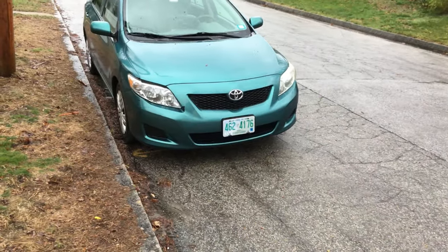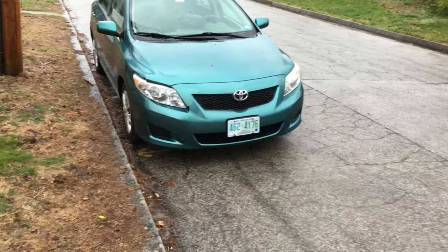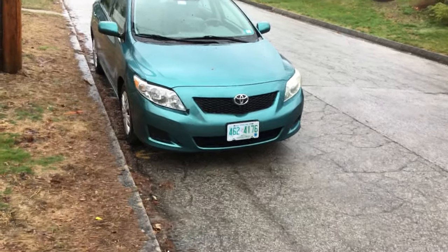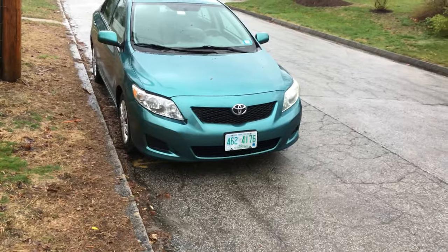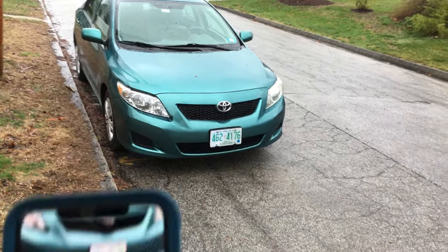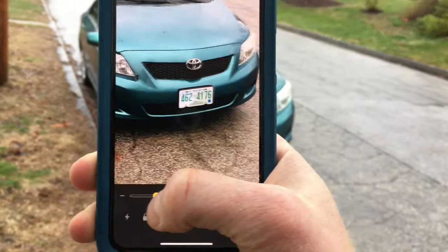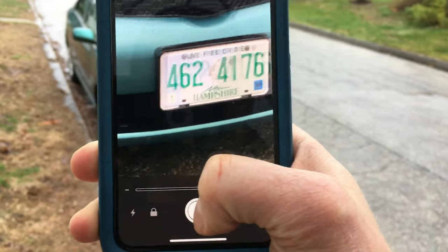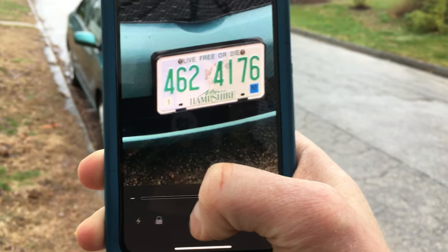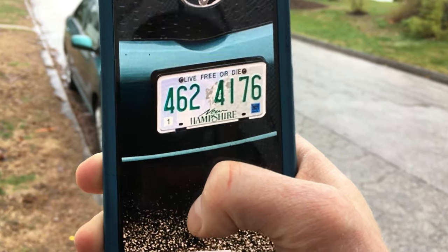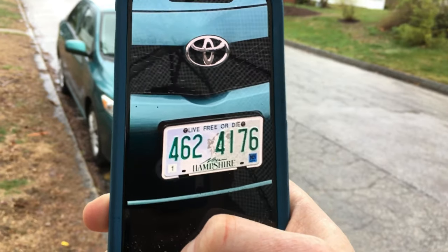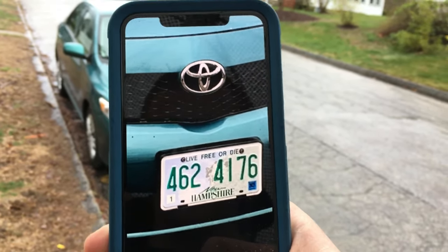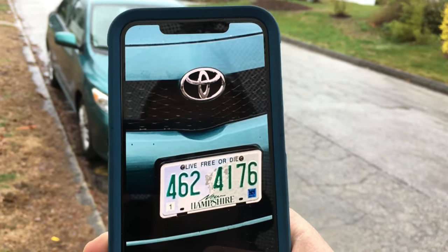For my next real-life example: many times if someone is taking an Uber or Lyft, they want to confirm they're getting into the right vehicle, and one way to do that is by checking license plates. You can zoom in and lock it as a way of confirming the license plate. You can also use this for the make and model — it gives you extra reassurance that this is the right car you're looking to get into.